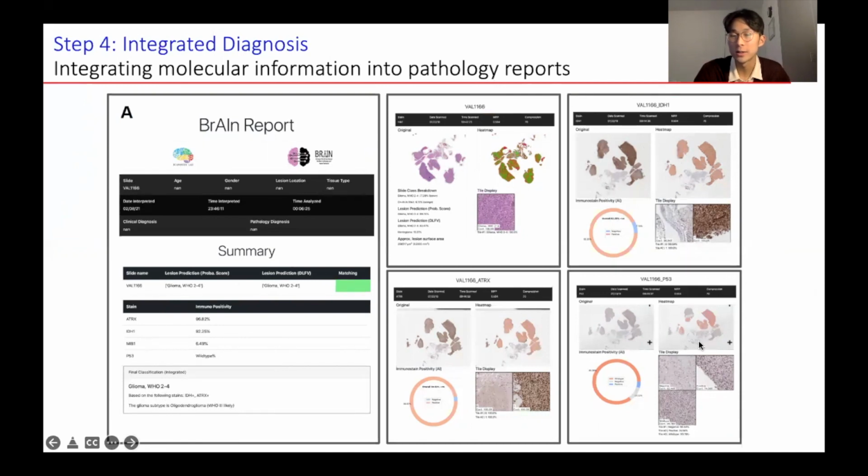And so this, we hope to be able to generate a report that has also other information, as well as being visually appealing, showing the different whole slide images, different heat maps, for example, different pie charts to show the different positivity, etc., and maybe perhaps even example tiles.